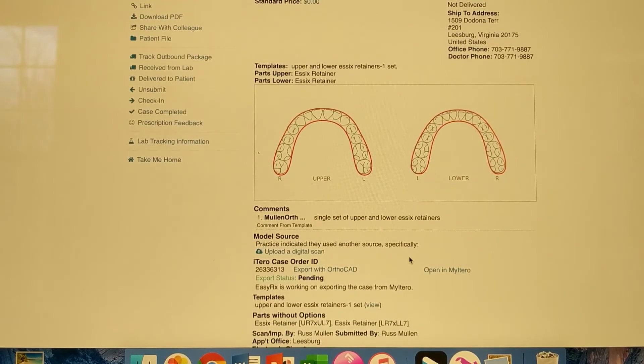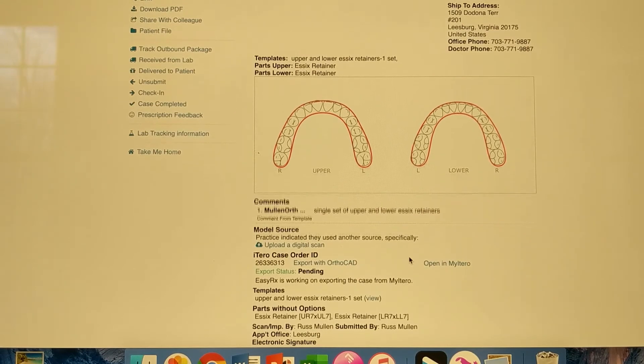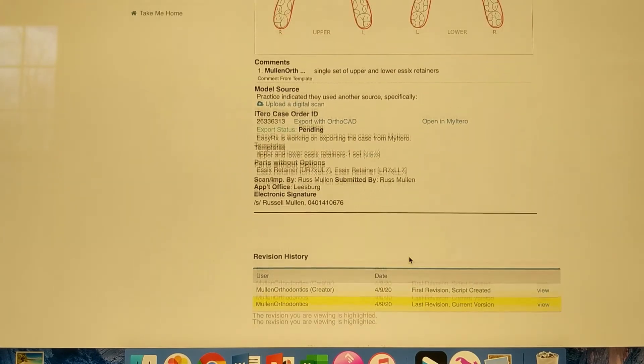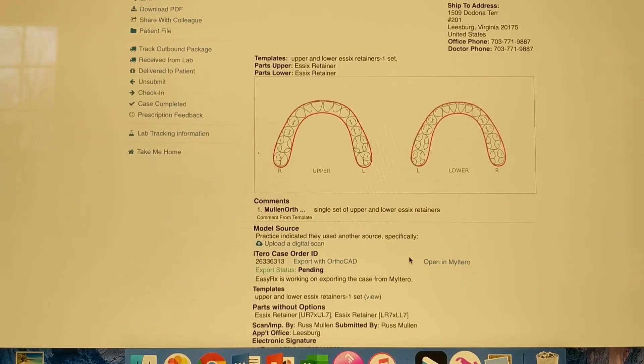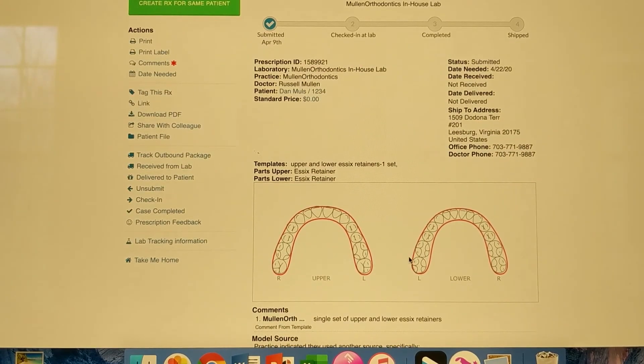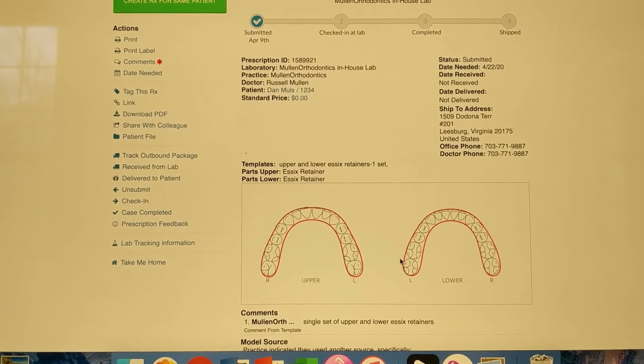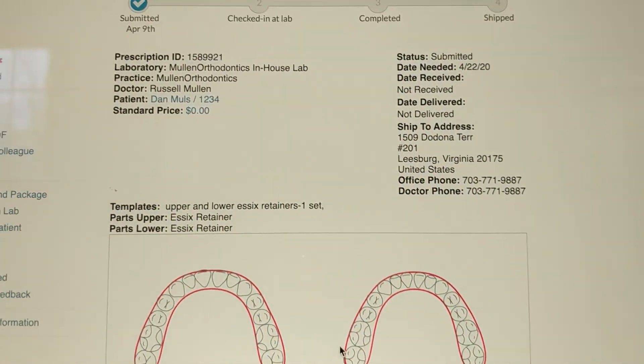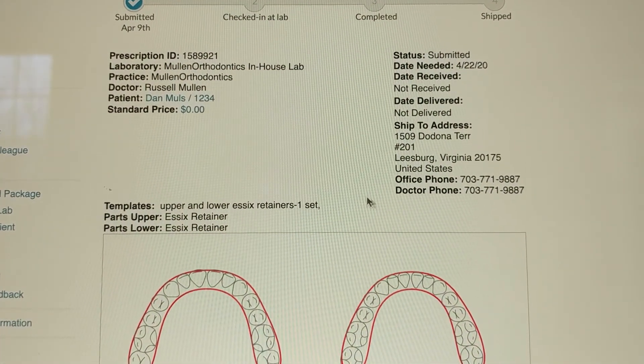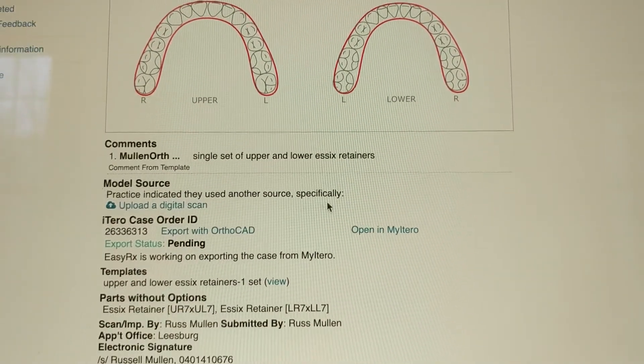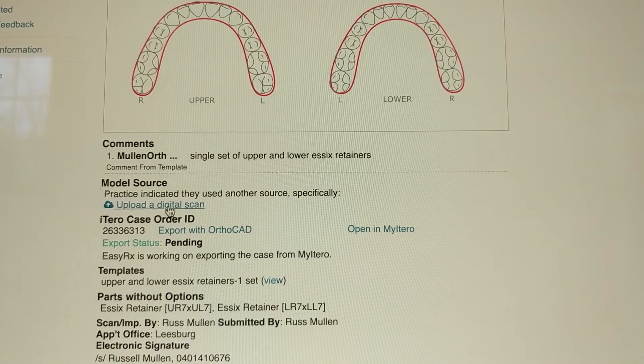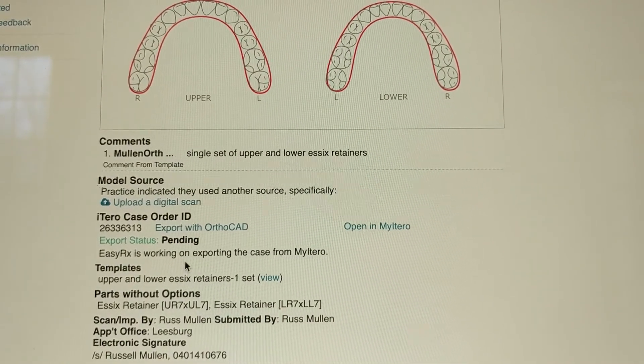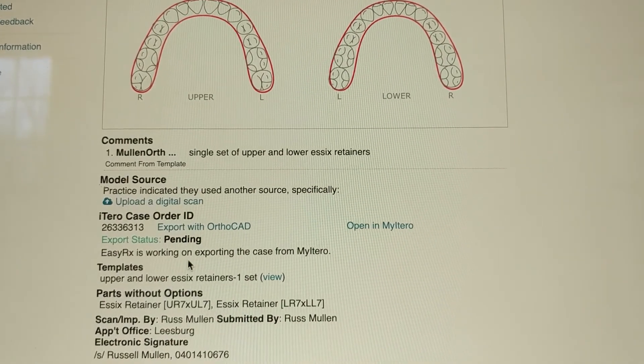And so that is the lab prescription. So now if you can see, this is on the lab, on file here. So we're going to do, I'm going to skip down and EZRX is working on exporting the case from my iTero.